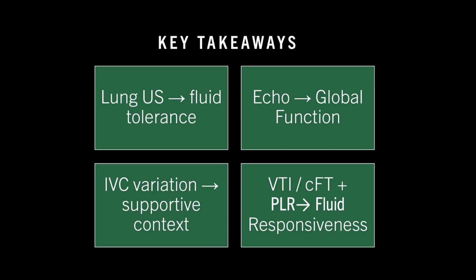So I know that was a lot of information, a lot of different calculations. Hopefully you find the slides and the videos helpful and can play back as many times as you need. And really, hopefully taking away from this lecture that POCUS helps us avoid blind fluid administration and its complications, and that we integrate multiple findings, lungs, IVC, heart, and VTI, and use dynamic tests whenever possible.